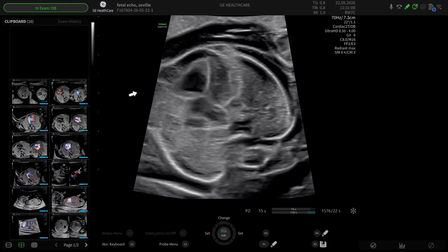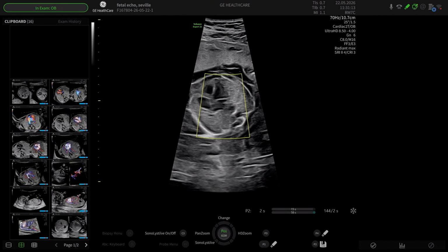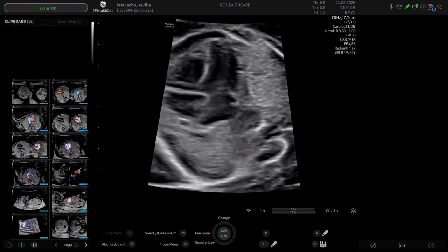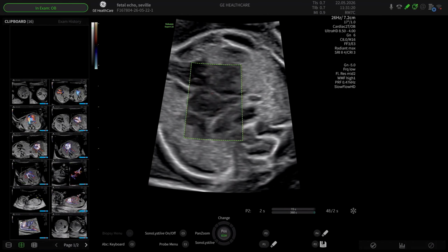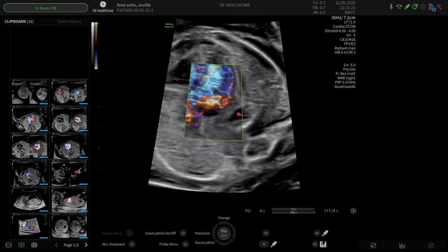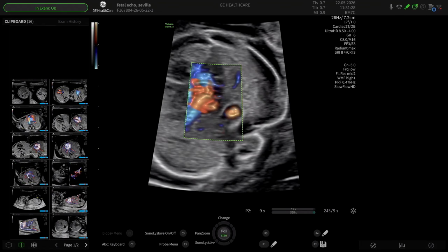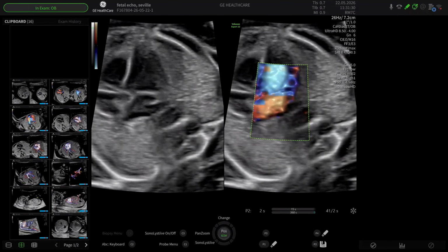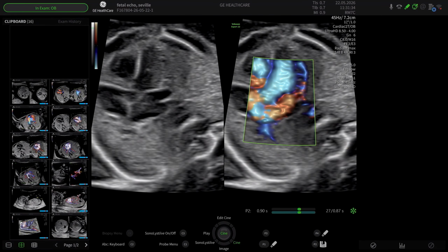As I'm looking at the pulmonary veins entering into the four-chamber view of the heart, I go up to the left atrium, and then I go back to my friend slow flow. The balance is held over from the last examination, so I have to bring my balance back up to 225, and then I go into a split menu. So I go into a 2D and a 2DC, and then I look in the region of my left atrium, and you can see them there, the pulmonary veins. You don't really need slow flow because it's actually seen there in 2D, but it is showing me on slow flow here that the veins are coming in.